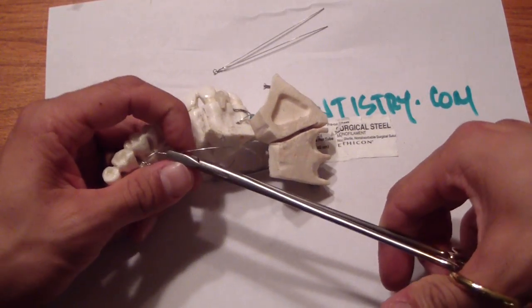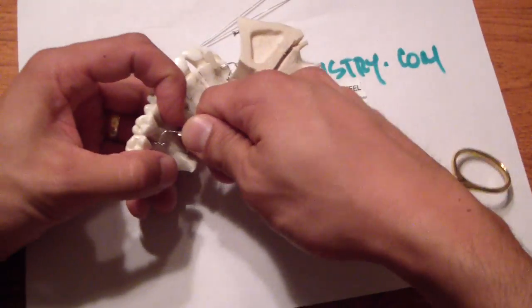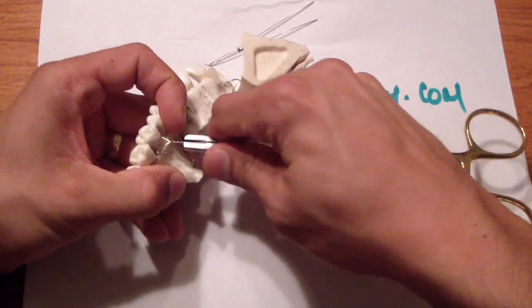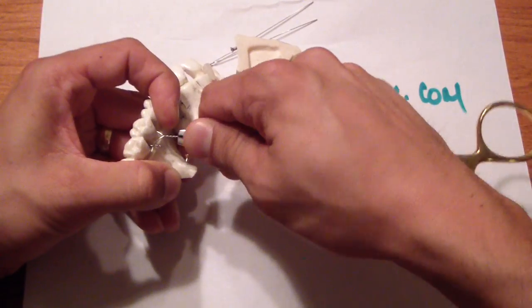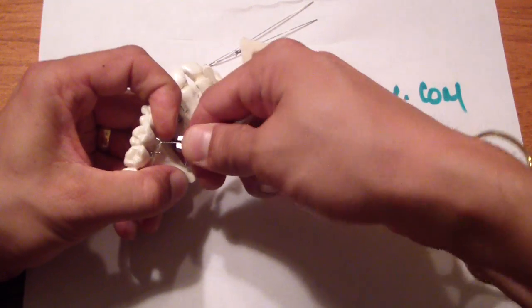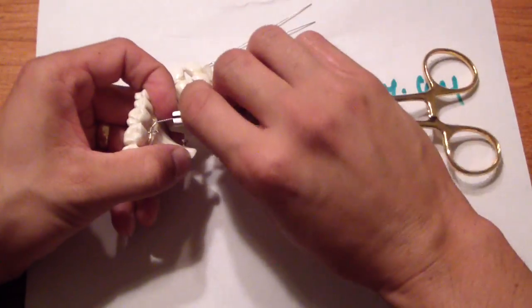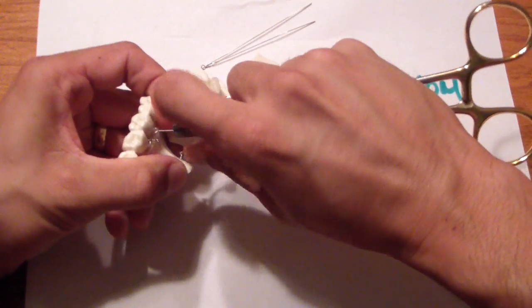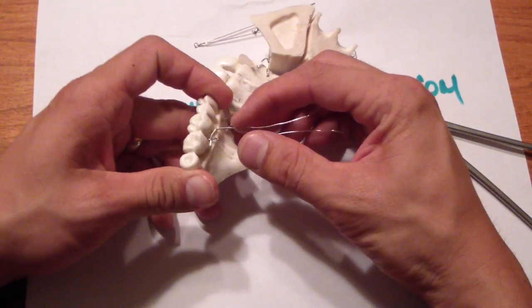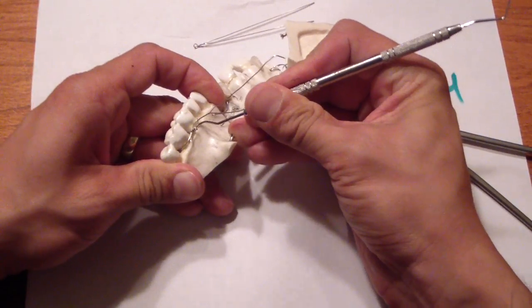There we go. So you see my hand like this — I'm going to come up here, grab the ends, with opposite force against the maxilla, pull it. See how I'm pulling a bit and slowly spinning? So you can pull and tighten — that way you're tightening it and not just simply spinning. I'm pulling and tightening. There we go. You can see how that's nice and tight. You can go check it — see if there's some movement. That's nice and tight.